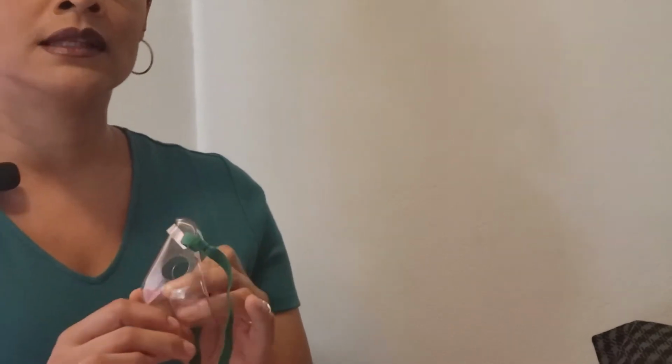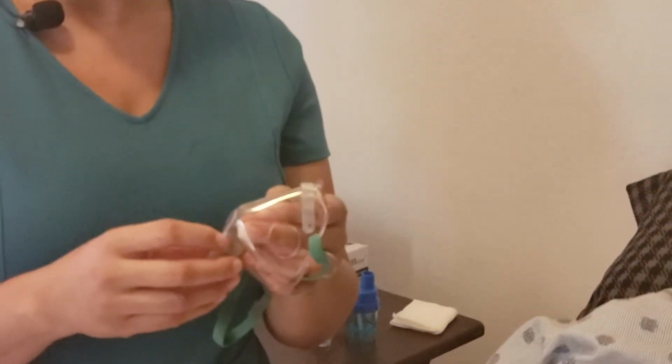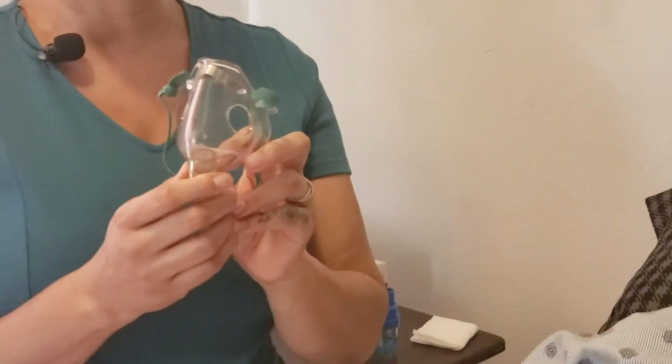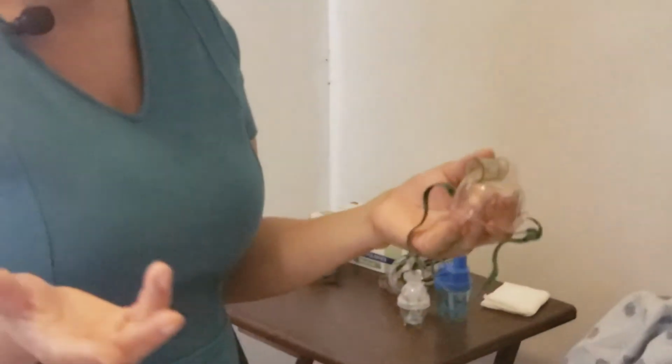These masks deliver 50 to 80% oxygen. And you know that's a very wide range, but we say 50 to 80% oxygen because they're losing a lot of the oxygen through these holes. This is the way it's supposed to be set up though. The flow for this can be up to 10 liters per minute, just because you're losing so much of it anyways.